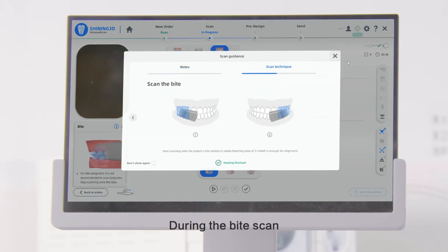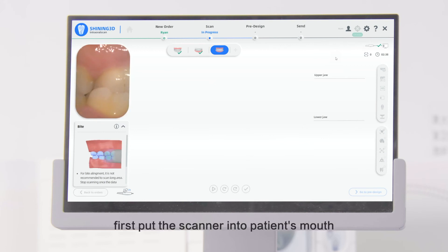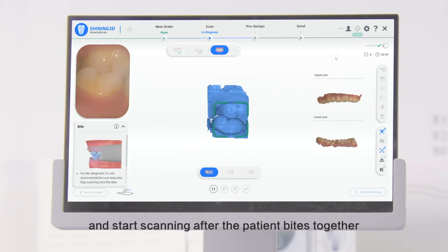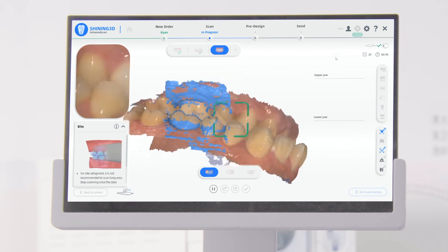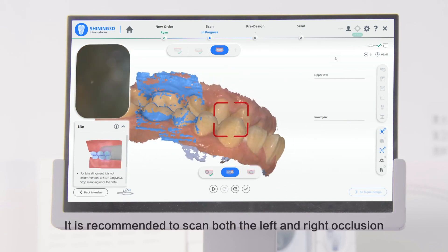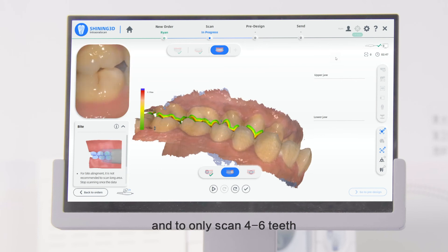During the bite scan, first put the scanner into the patient's mouth and start scanning after the patient bites together. It is recommended to scan both the left and right occlusion and to only scan 4 to 6 teeth.